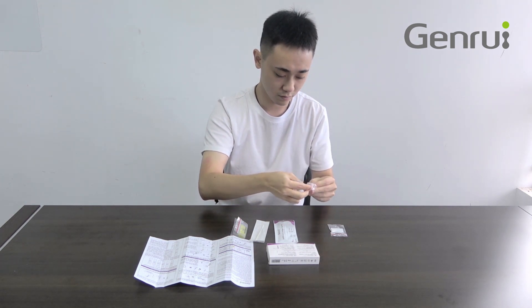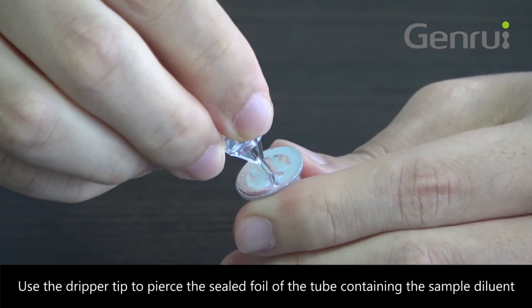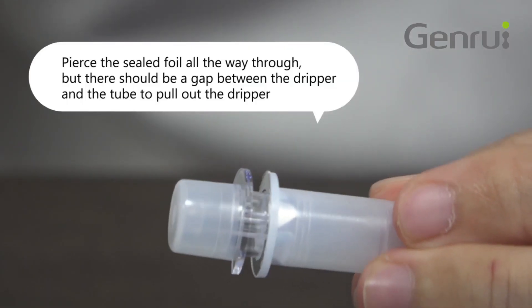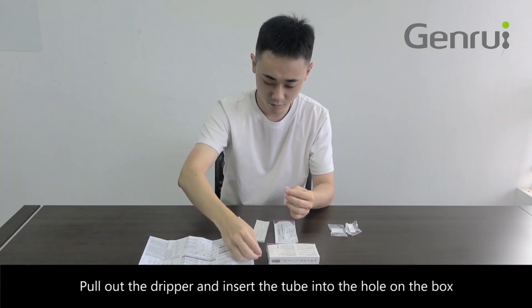Use the dripper tip to pierce the sealed foil of the tube containing the sample diluent. Pierce the sealed foil all the way through, but there should be a gap between the dripper and the tube to pull out the dripper. Pull out the dripper and insert the tube into the hole on the box.